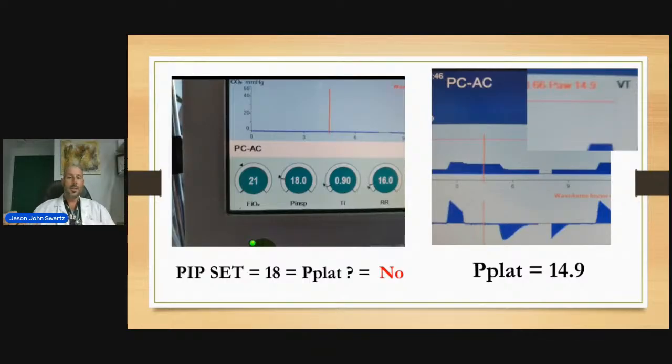And then, let's say your PEEP is 8, you have a total PEEP of 9.1. So now you have another unit of pressure. You might be thinking that you've already attained a drive pressure of 15, when in reality, no, your setting dropped by 3 and the other one by 1. So you might be only at 11. So it gives you room to breathe, where you could say, oh no, I'm not actually past the danger zone for drive pressures.